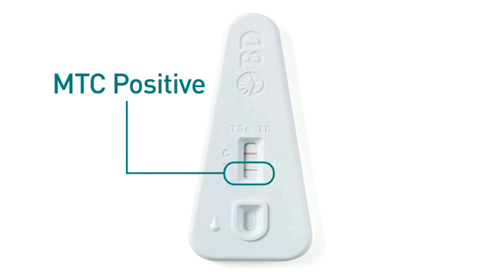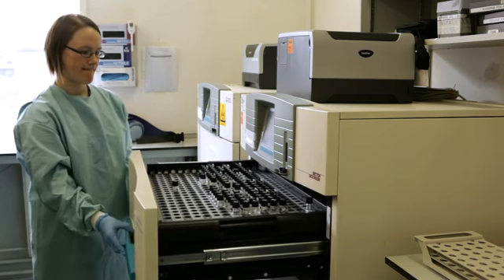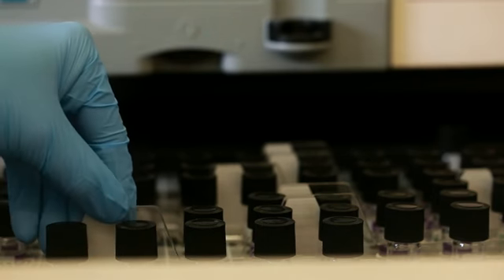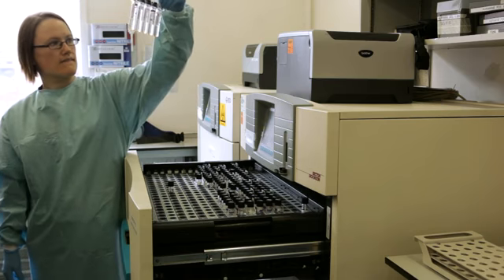Atypical mycobacteria and further speciation of MTC isolates are identified using a molecular line probe assay. These assays are batched and performed on a weekly basis. Sensitivity testing is performed on the first MTC isolated from a patient. This can take up to 14 days after becoming culture positive.